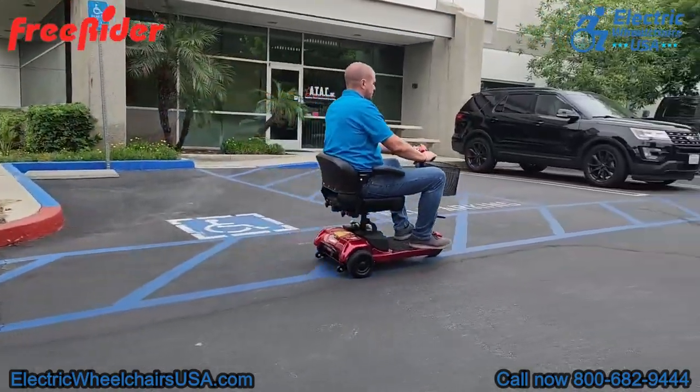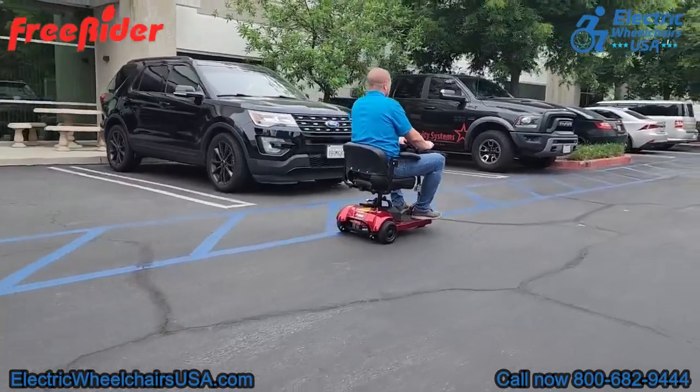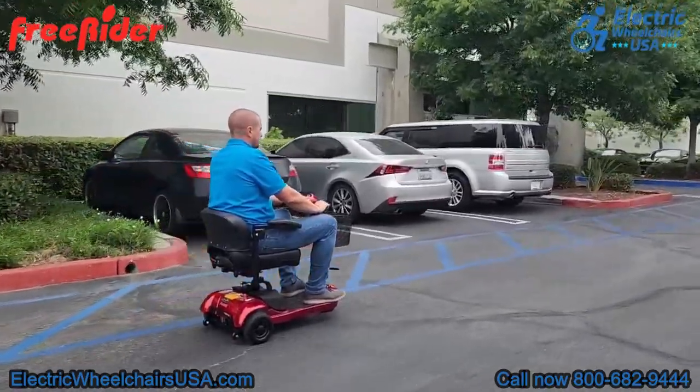It offers a 325-pound weight capacity, a top speed of just under five miles per hour, and the battery range is around 15 miles on a single charge. So let's get into it and show you a little bit more about it.